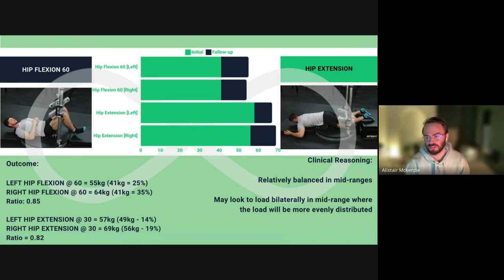And yes, we tried to steer it in a certain direction, but ultimately we're using KangaTech to get insight around which route his body is taking to distribute the load, and can we enhance it for the stage. So there's relative balance here, right?